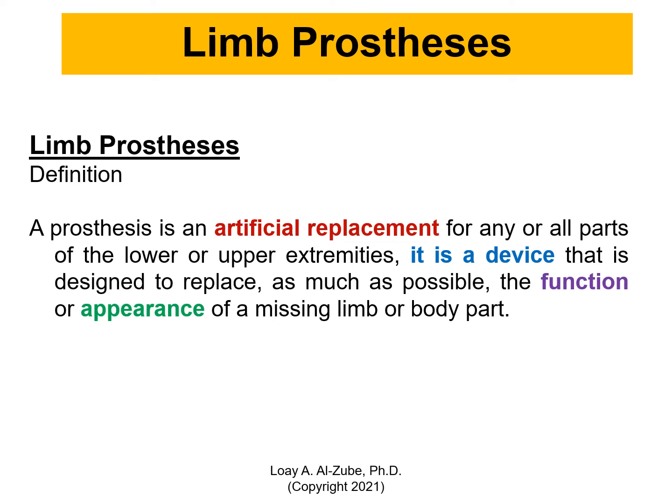What if I have an active prosthetic arm that is connected to the nerves, and then you can have an infection? That could be life-threatening. Now, let's say a wheelchair that is not fitted well. You're creating ulcers, and the subject is paralyzed, let's say does not feel. That's life-threatening with the ulcers. So that's how we look at it.